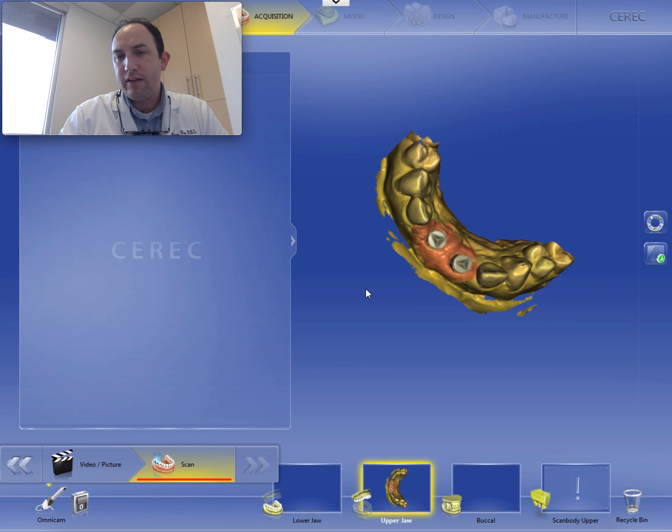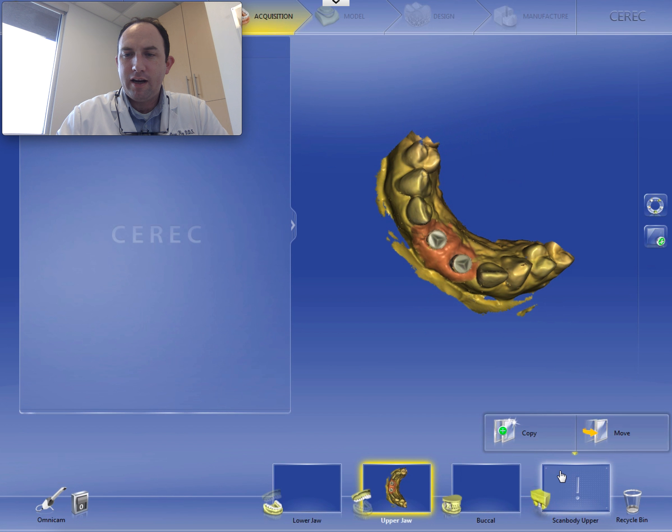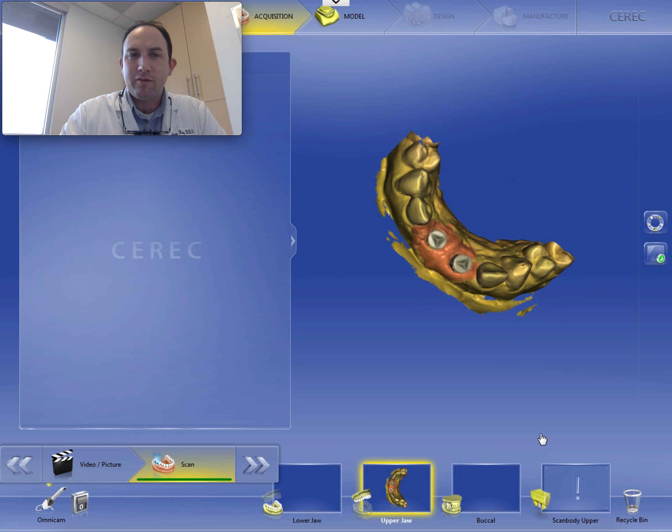I don't feel the need to create a separate scan set. So I'm going to grab this, drag it over, release the button, and hit copy. Now the computer is replicating that image set over there, and you can see we have the green check. So we're good to go.